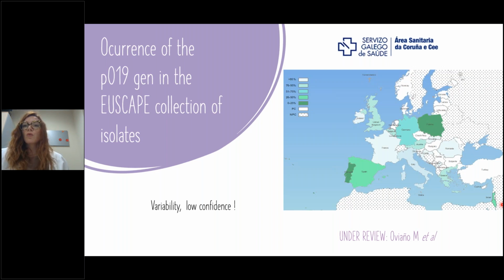So this approach has high variability and really low confidence. So you first have to analyze your bacterial genomes, so you can be sure that this biomarker you are observing in MALDI-TOF is really indicative of resistance, or maybe not.